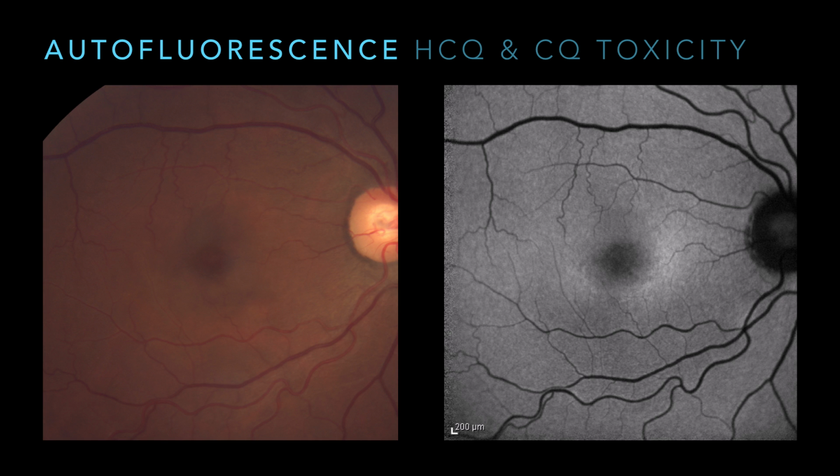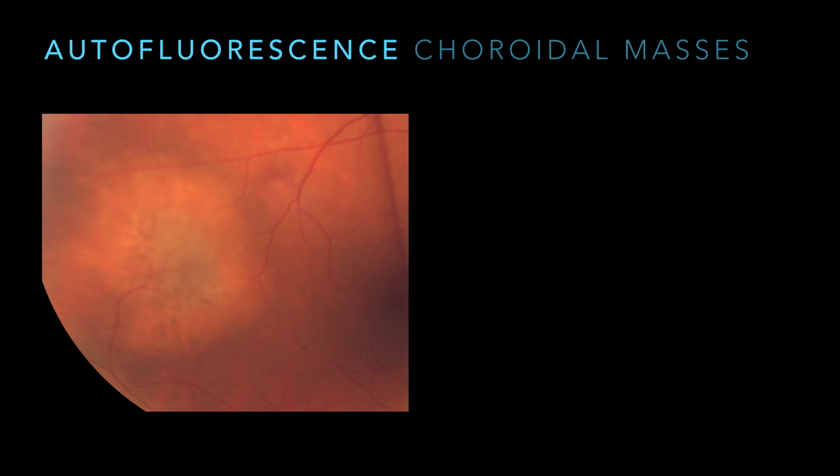If anybody else wants to weigh in on that too, this is a pretty open forum, even though I'm going fast. In the instance where the multifocal is abnormal when it started, it's probably not from the Plaquenil. Right. No, I don't think it's from the Plaquenil. My line of thinking is that they're at a risk for developing toxicity. Right. Yeah, there's a couple different approaches. One, if you can tell the difference between a different retinal process distinctly different from chloroquine, is it okay to keep them on chloroquine or Plaquenil? That's one question. The other question is if they have another process, does that predispose them to earlier toxicity? And that's the bigger concern for a lot of retina specialists.